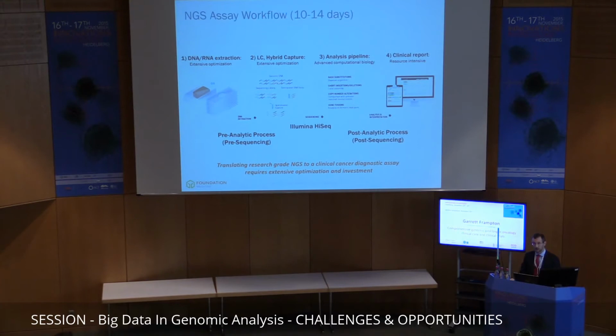Then you do sequencing library construction and hybridization-based target capture to pick just the regions of the genome that you're interested in assessing. Then these libraries are sequenced to high depth using the Illumina HiSeq platform right now. And there are mutation detection modules that are used to identify each of the different classes of alteration that are present in a tumor specimen.